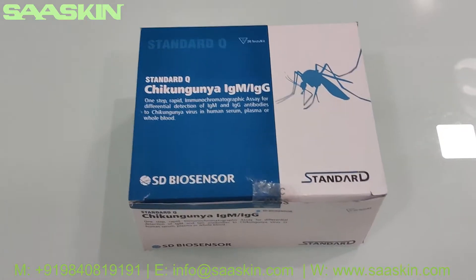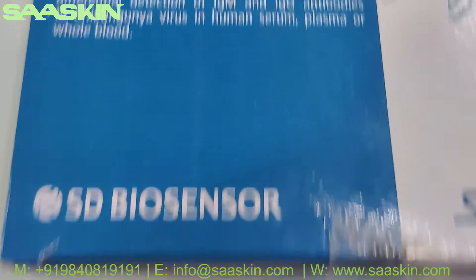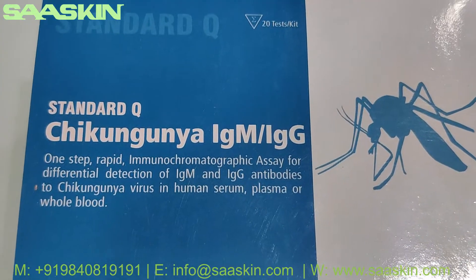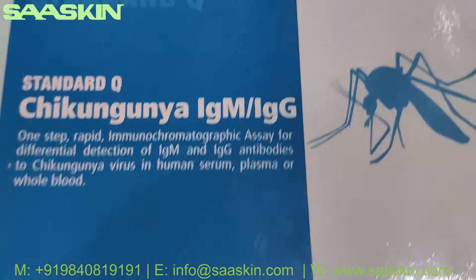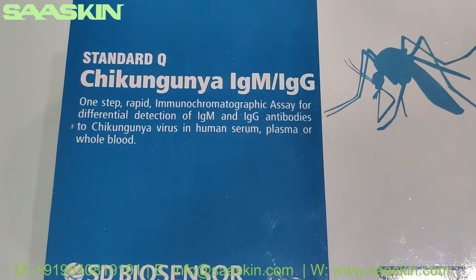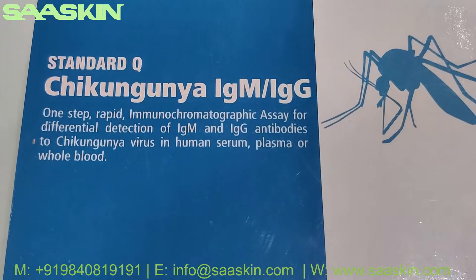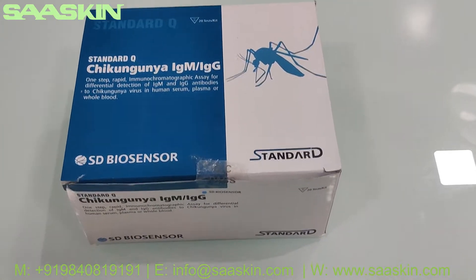Hello everybody, today I'm going to unbox the SD Biosensor Standard Q Chikungunya IgM IgG antibody test kit. This is a 20-test kit box — a one-step rapid immunochromatographic assay for differential detection of IgM and IgG antibodies to Chikungunya virus in human serum, plasma, or whole blood. This is how the kit looks like.